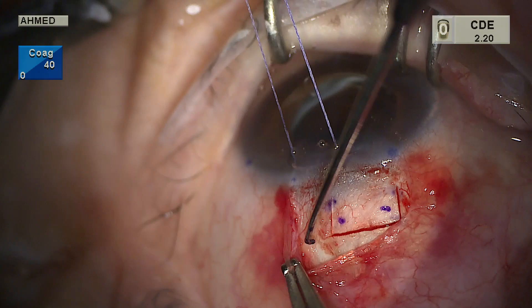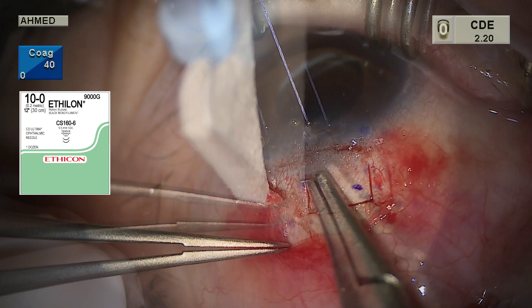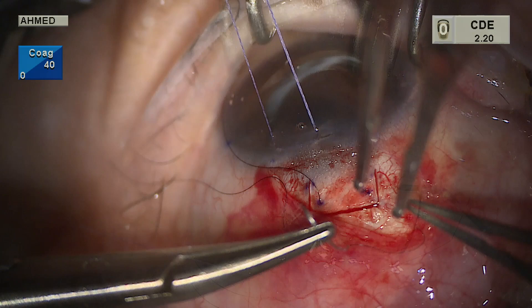Prior to entering the anterior chamber, we pre-place 10-0 nylon sutures. These passes should be at least 1.5 millimeters long to allow for easy burying of the knot. We enter full thickness adjacent to the flap at each corner and pass in a radial fashion to create the corner sutures. The two sutures placed at either corner should provide enough resistance to partially close the flap.